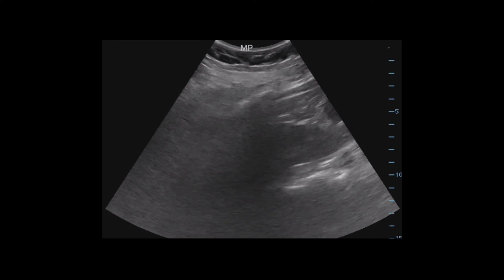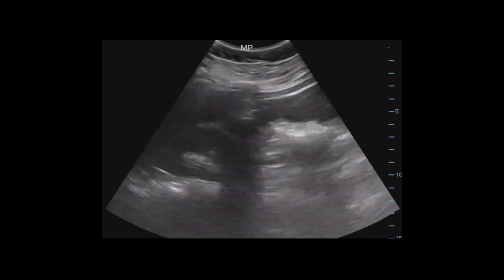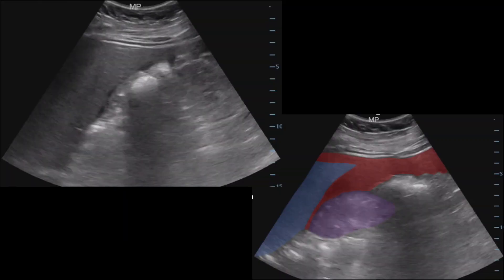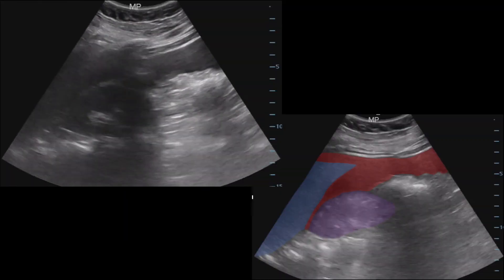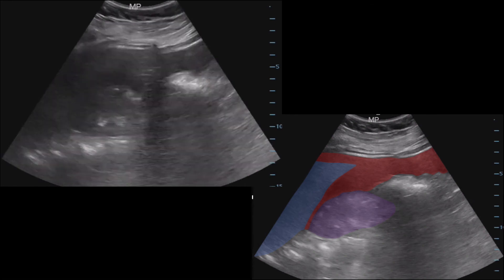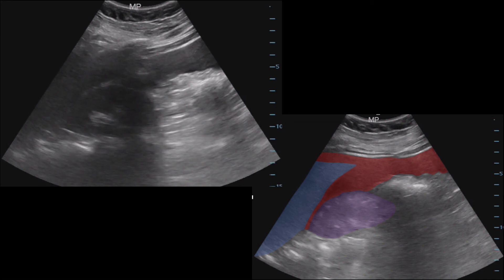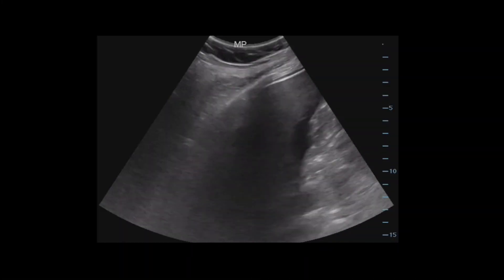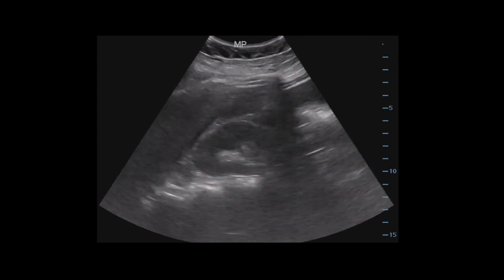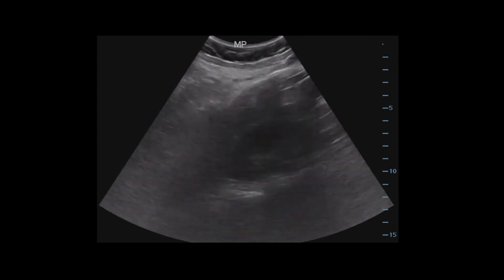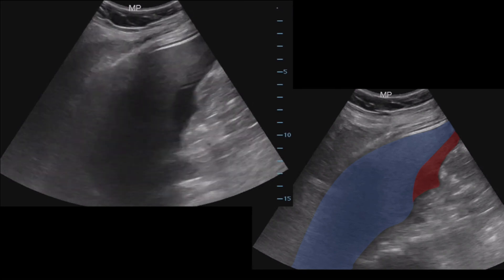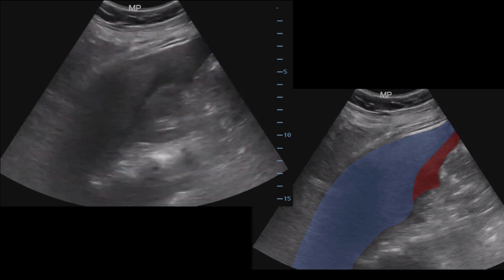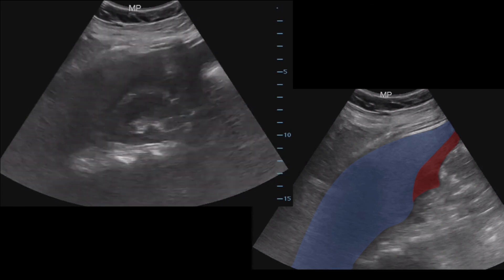The first image was obtained by placing a probe at the mid-axillary line with the probe marker facing the axilla. This gives a view of Morrison's pouch, which many know as the hepatorenal view. The Morrison's pouch view is grossly abnormal — there is a large amount of hypoechoic free fluid surrounding the liver tip, highlighted in red with the liver in blue and the kidney in purple. A second right upper quadrant view in a slightly different orientation again shows the black hypoechoic fluid in the hepatorenal recess. These views highlight the importance of scanning the entire anatomy rather than relying on just one clip.